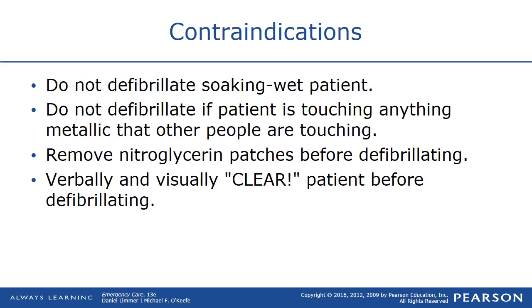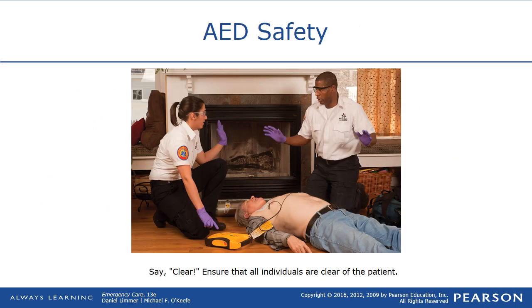So do not defibrillate soaking wet patients. That's dangerous. Dry them off. Do not defibrillate if the patient is touching anything metallic that other people are touching. Remove nitroglycerin patches before you defibrillate. Verbally and visually clear the patient before you defibrillate. Make sure everybody is clear. So be safe when you're operating a defibrillator.